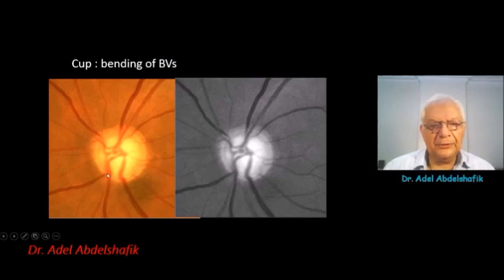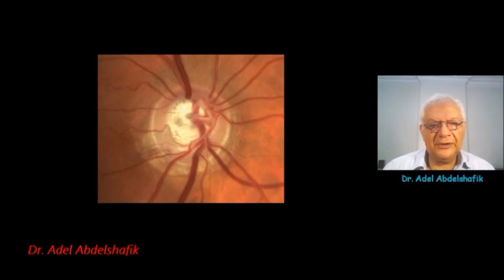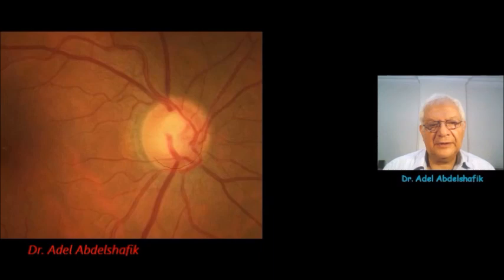What about the cup? We follow the blood vessels, especially the medium-sized blood vessels, and we check any change of the direction of the vessels. As noticed here, you can see the reflection along the vessel — it disappears in this area, so we get a change in direction at this location. This is the outer limit of the neural tissue, just inside the border tissue of Elshning, and this is the location of the change of blood vessels — this is the limit of the cup. Sometimes it's not visible all around, but in many areas you can define it certainly.